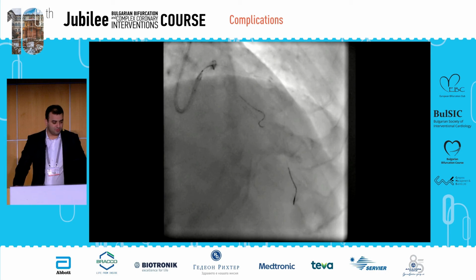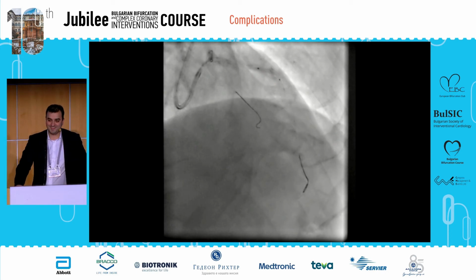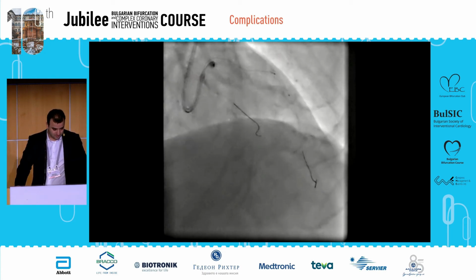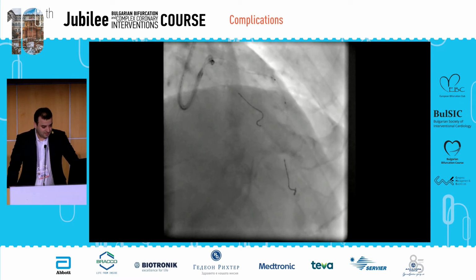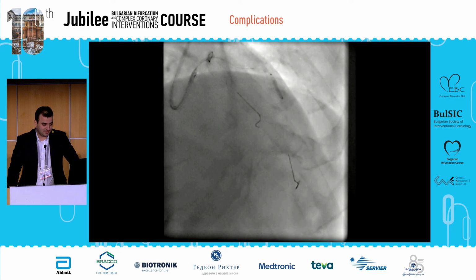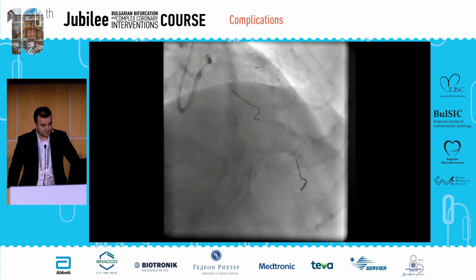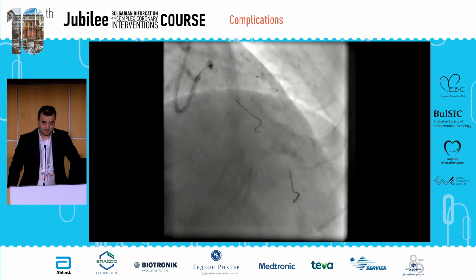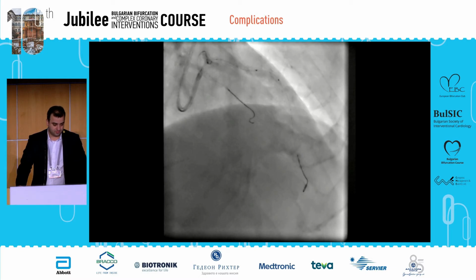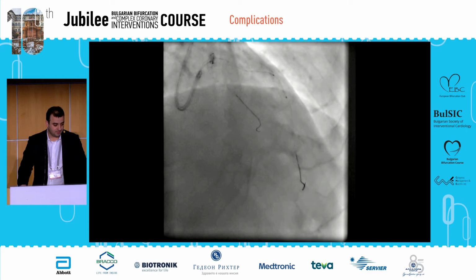And I took a 2.0 balloon and passed through easily. I was really happy. I inflated the balloon. Yeah, we are almost there. I inflate, pull it back. I said, okay, I'll deal with this complication really easily. I'm happy. But the plastic part was out. I said, okay, it is a bit tricky to continue trying to cross into this plastic part.